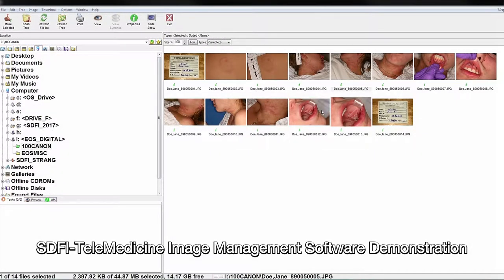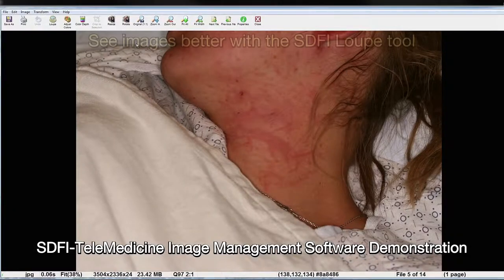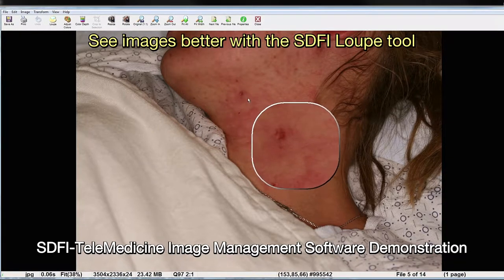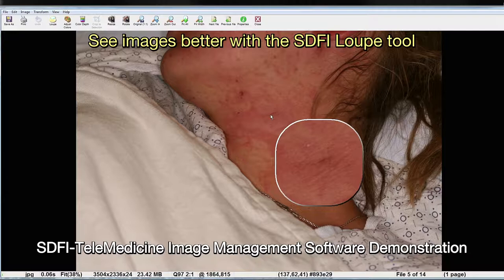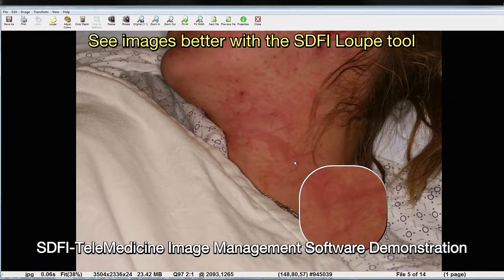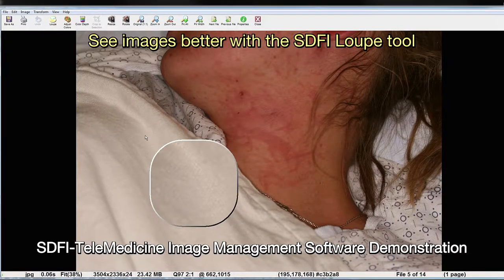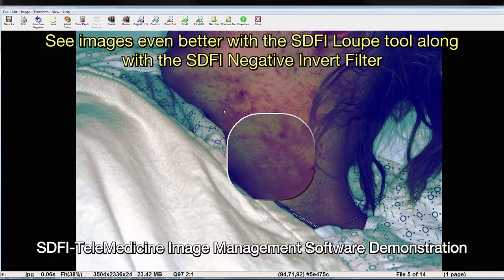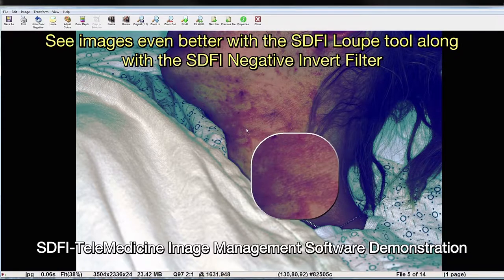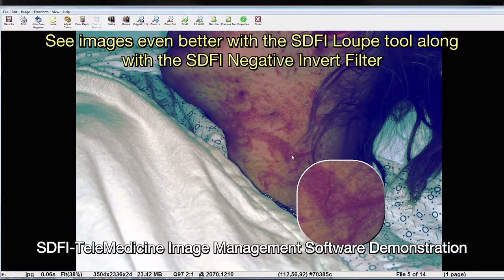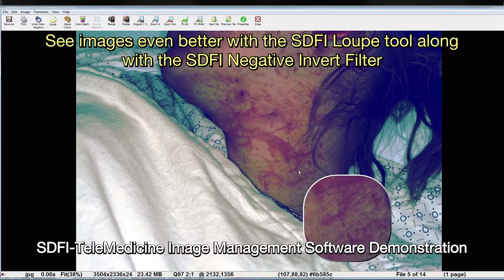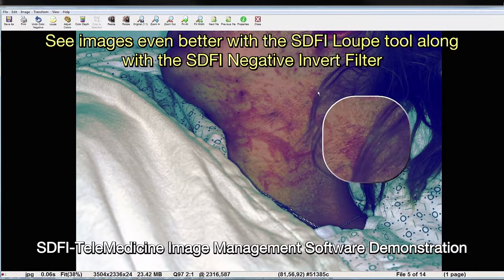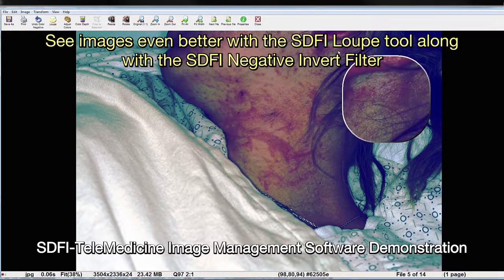Using your image management software on the exam computer, review each image and document any findings. In this example, the image management software includes tools like the magnifying loop tool so that you can inspect each image at 100%, and the negative invert filter to help identify and highlight any areas of interest. It can be helpful to have peers and/or specialists also review the images to confirm any findings during the review and documentation process.